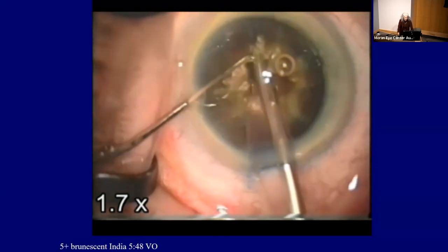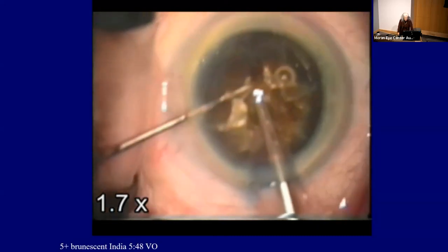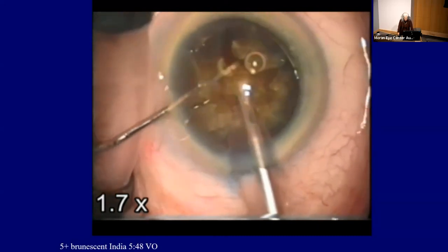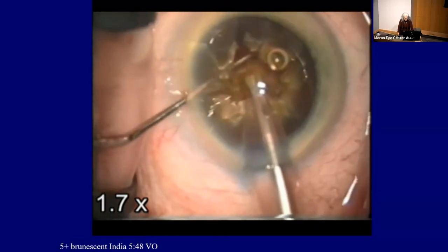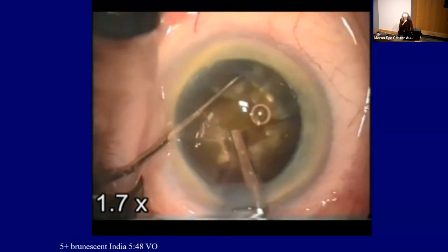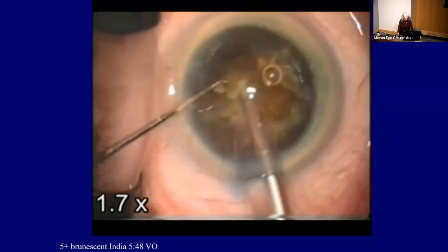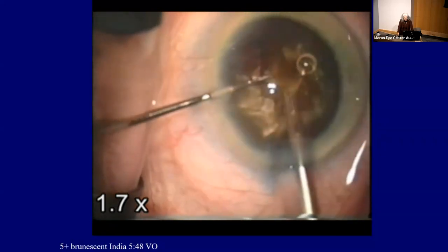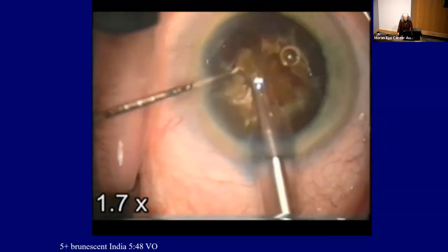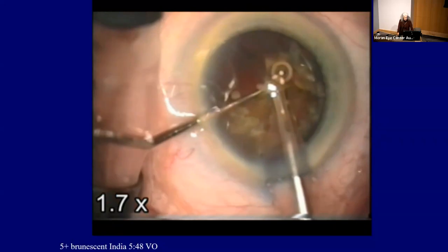I want that to stay intact because it's going to protect my bare posterior capsule, which has virtually no cortex to protect it. And most of the time, the zonules are rather loose. So this keeps it all expanded. You can see I've made my nucleus mobile. I'm opening it, and you see how I'm using the second hand very actively to lyse the little attachments at the posterior plate right there.